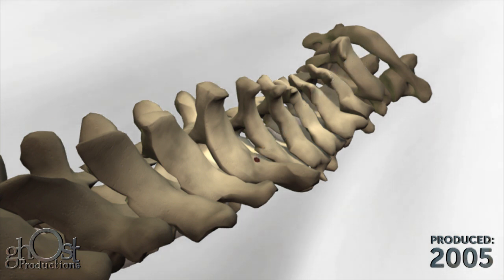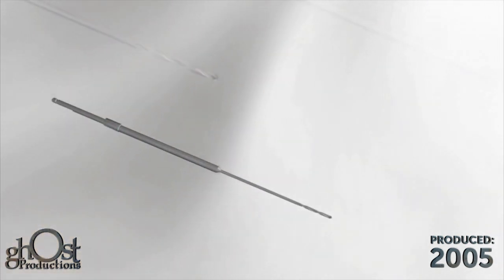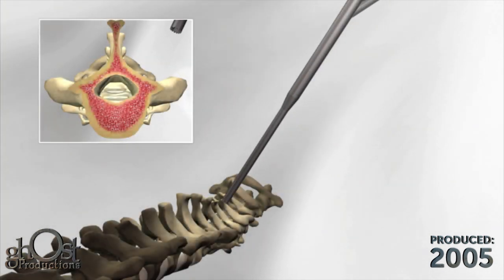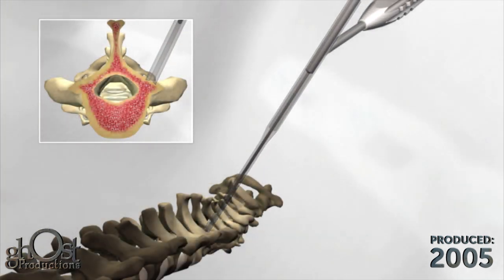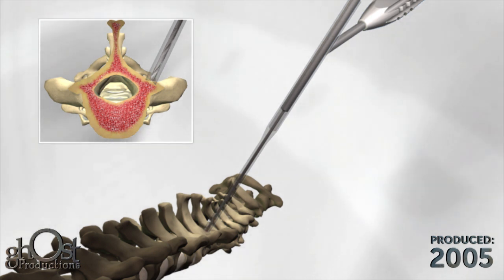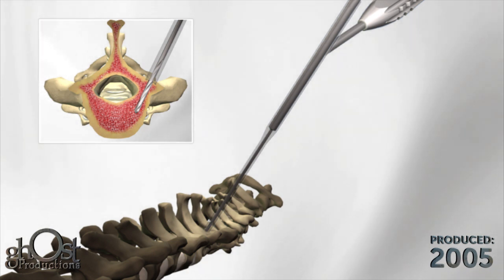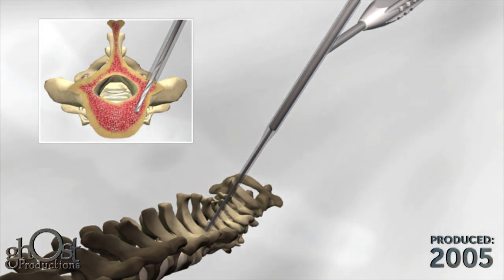Drill bits are provided in various lengths with quick connect fittings to attach to the modular handle. To drill a hole, select the appropriate drill length, place the drill bit into the barrel of the drill guide, and apply downward pressure while turning the drill clockwise until the step of the drill shaft contacts the guide.